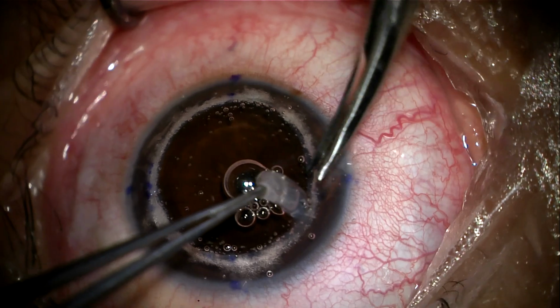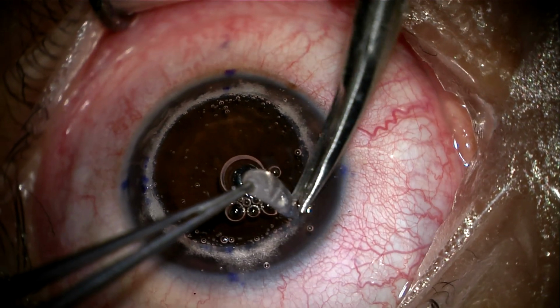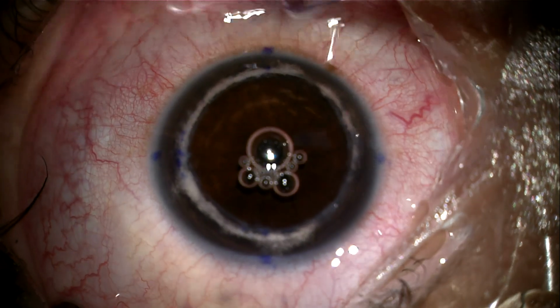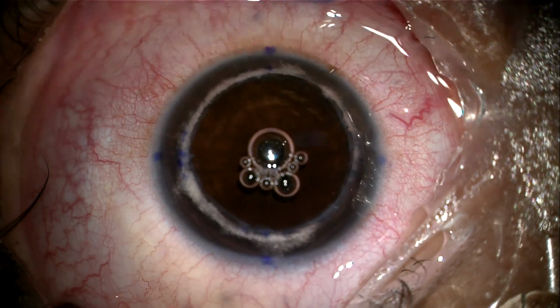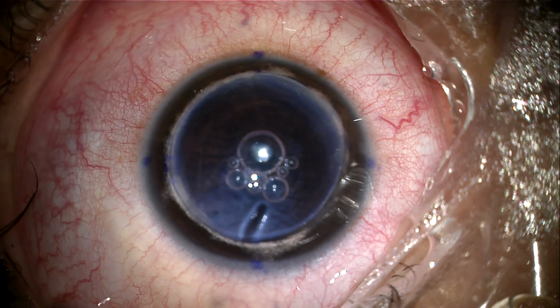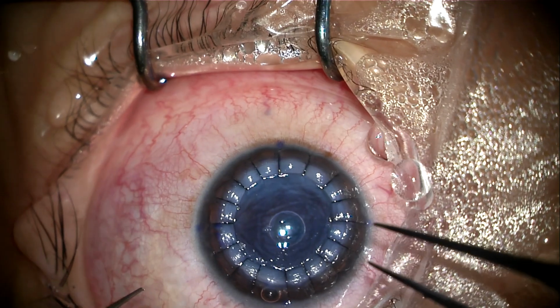Viscoelastic and debris are then removed by thorough irrigation of the bed. And finally, a Descemet membrane-free corneal graft is then placed on the predescemetic layer and sutured by 16 interrupted 10-0 nylon sutures.